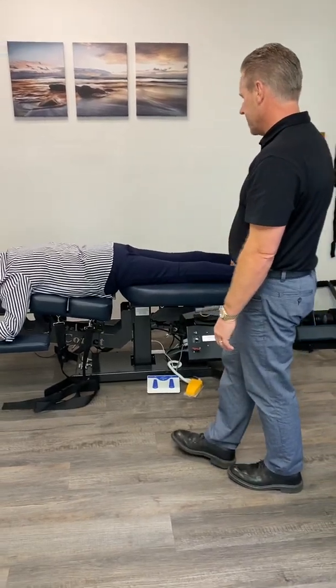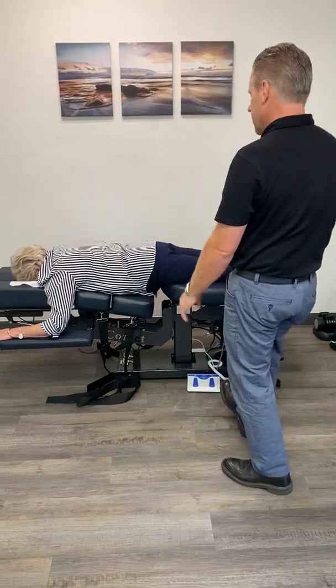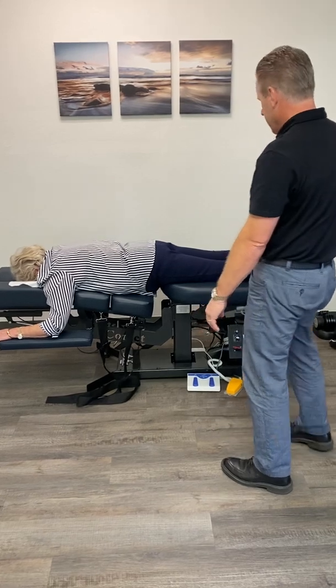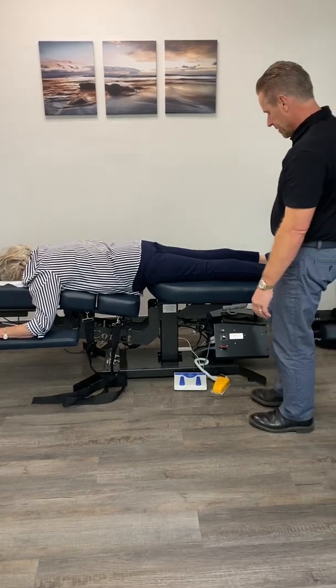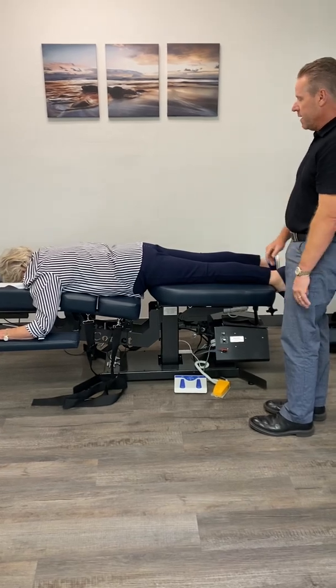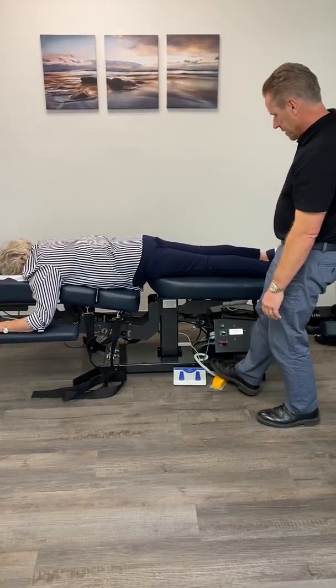So, Mom, what you're gonna feel is this lower half is gonna go up and down. If you feel pain, let me know, and I'll stop the machine, okay? The range of motion, we do not control. That's always gonna be the same, but the speed we do control. So this is gonna be a little slow. And notice that I'm doing this before I add traction, because traction is a little bit more aggressive. So we're just gonna go down.